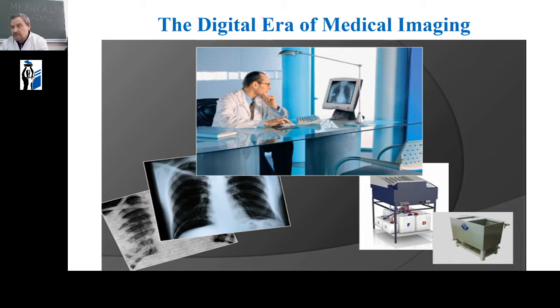There was an era when they tried to make X-rays on paper in order to save silver. This is a technique of electro-roentgenography. Now, this technique has historical significance.